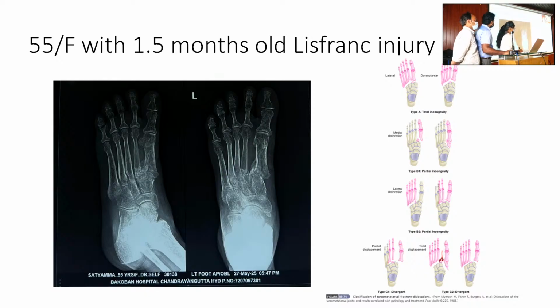What else is there? X-ray? Anything you are seeing, what is it? Accessory navicular. After saying so many times. Right. When you are encountering a case of an injury, it is not only for the fracture that you should look at. You should look at other things like a radiologist. They will search all corners of the film and try to report it. Any classification for navicular? Excellent.